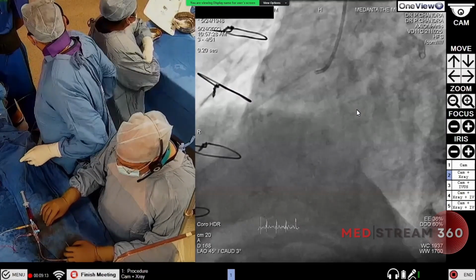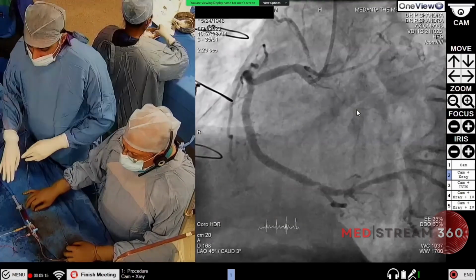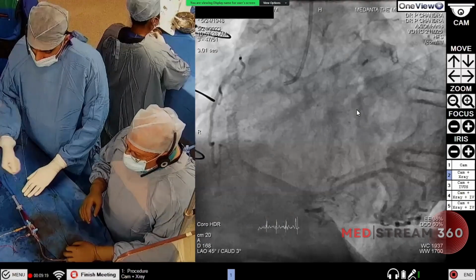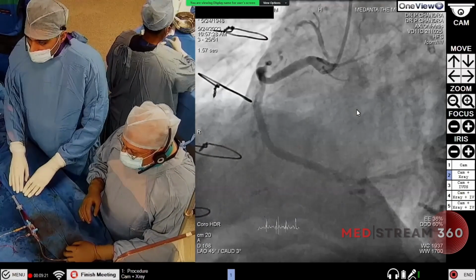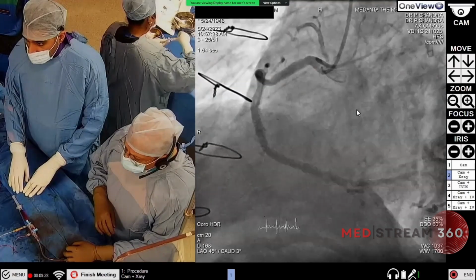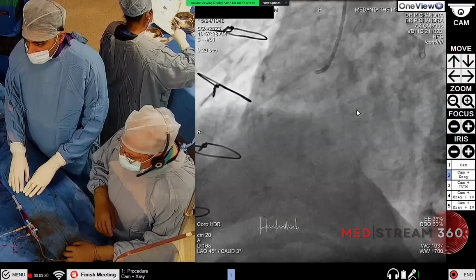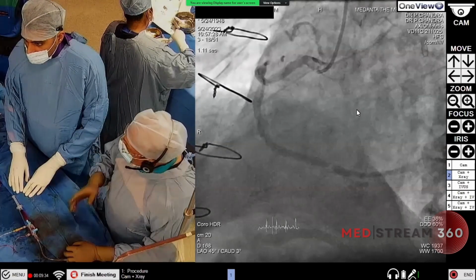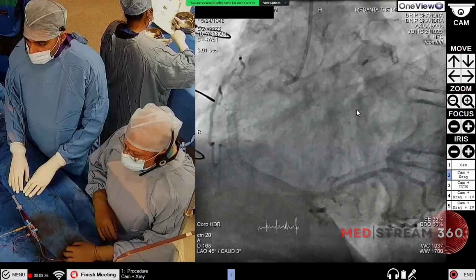So why I'm saying calcified? Because on angio and also a CT was done before this. A CT showed that this is a very heavy calcified artery on the CT, and the score was very high. Plan to do the angio now, and we see that yes, that tight lesion is there, which is most likely the culprit leading to unstable angina in this situation.